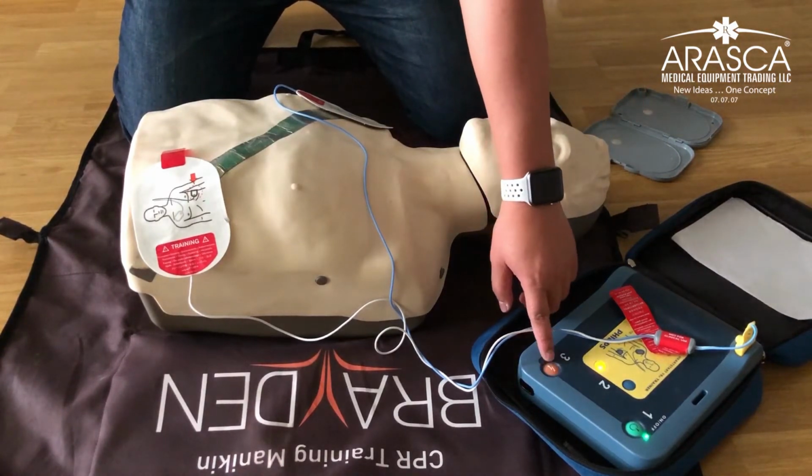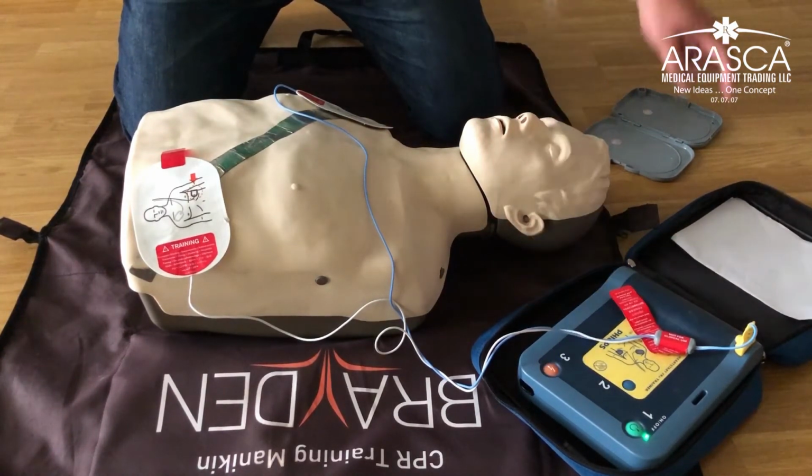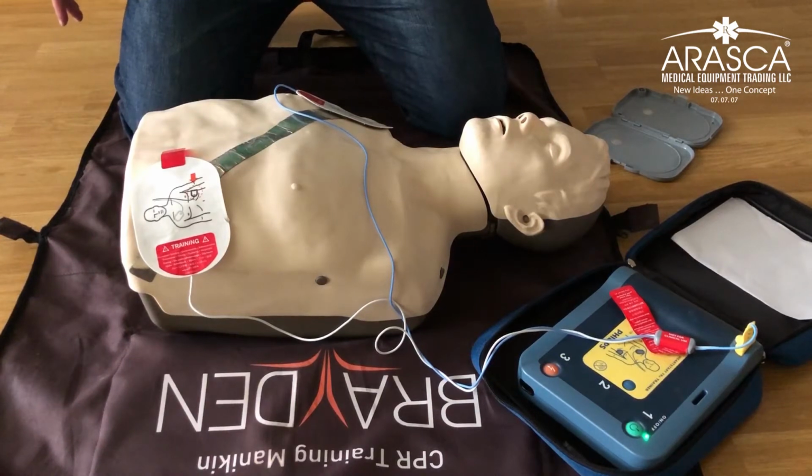Press the flashing orange button now. Shock delivered. Be sure the ambulance service has been called. It is safe to touch the patient.